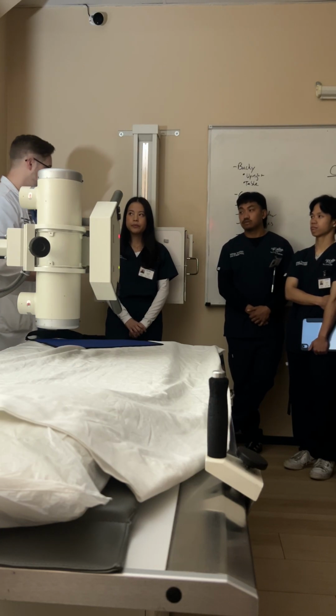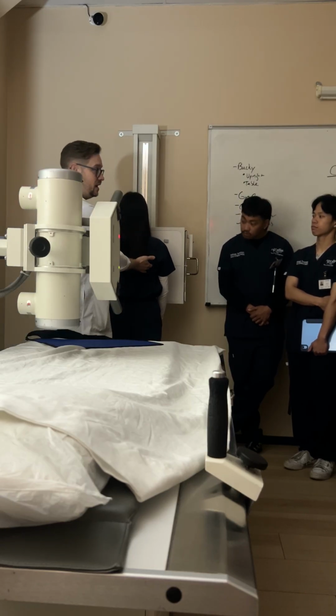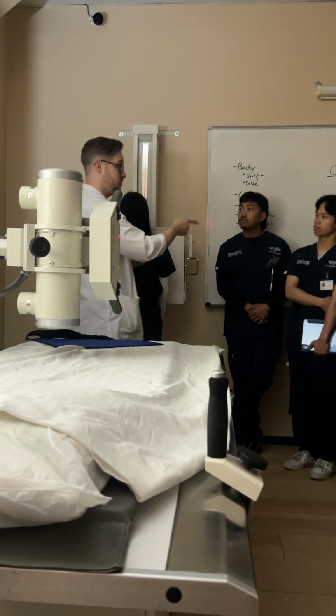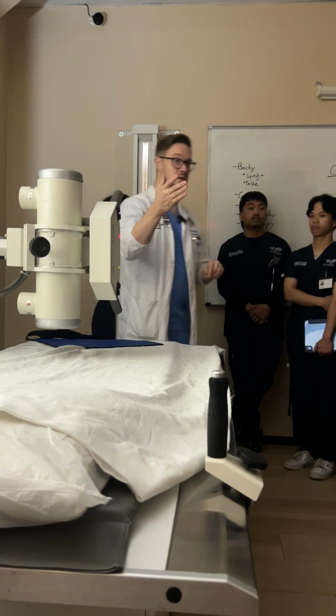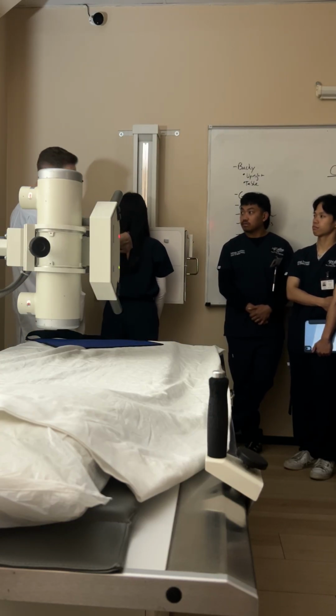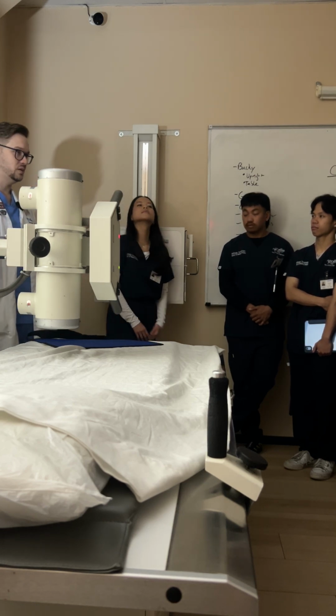So I always, let me turn around, feel inferior angle of the scapula, and I know that for Victoria, that's the center of her chest, and it will be different for you and everybody else, okay? Could that work? Sure, probably, but I don't know that it will work as precisely for every patient, so I don't do it that way.